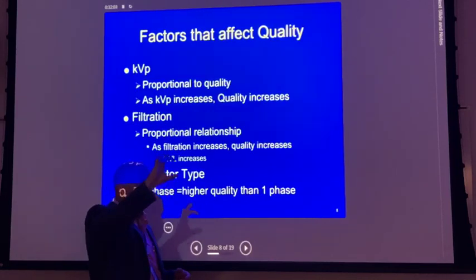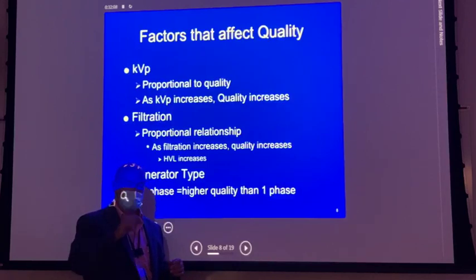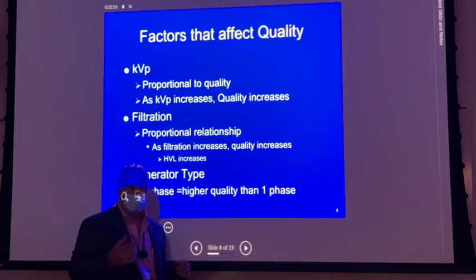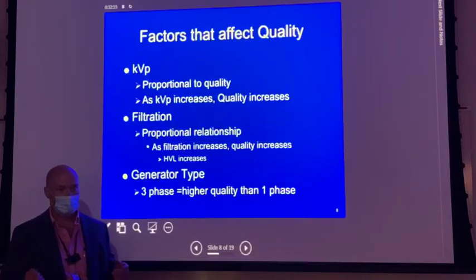It's only about that big around, and it's solid copper, and it's got a hole in it. If you were to find a single phase machine and spin that top while you make an exposure, what you'll see is really pretty fascinating.